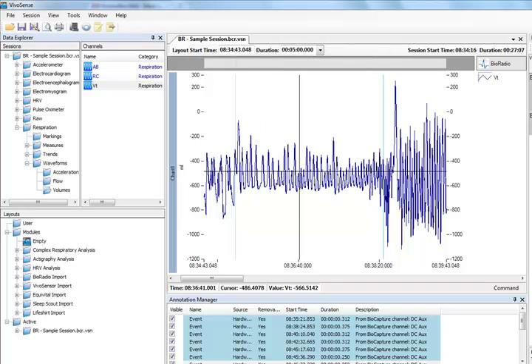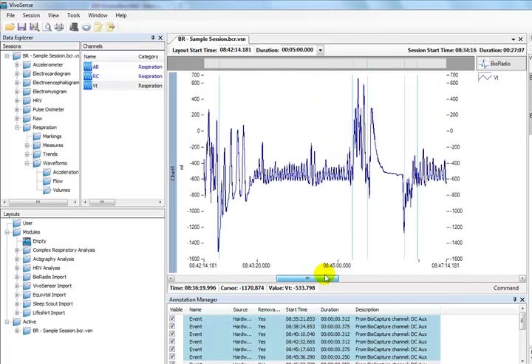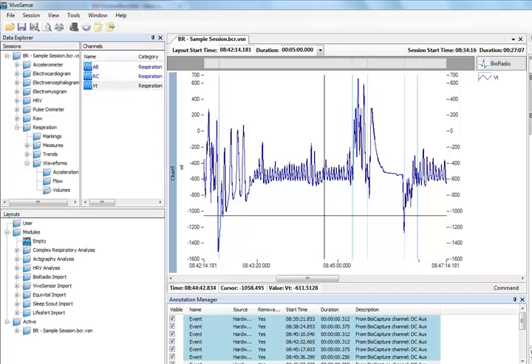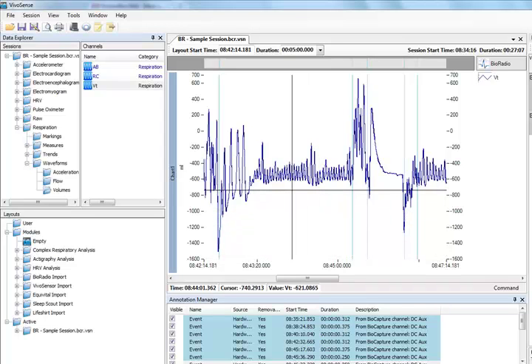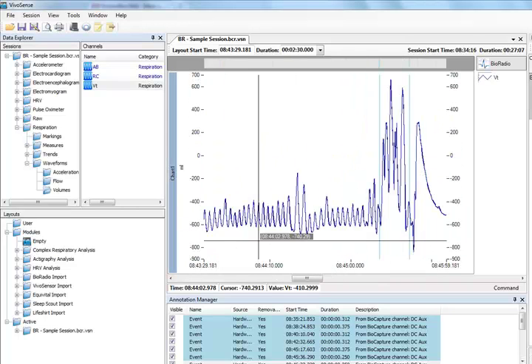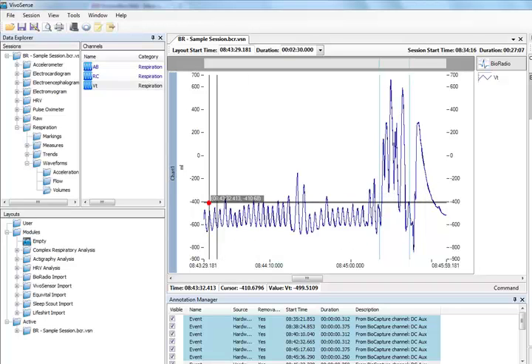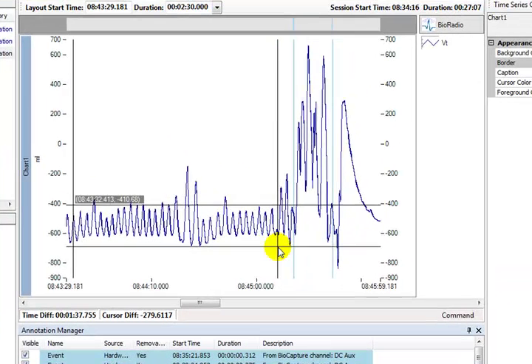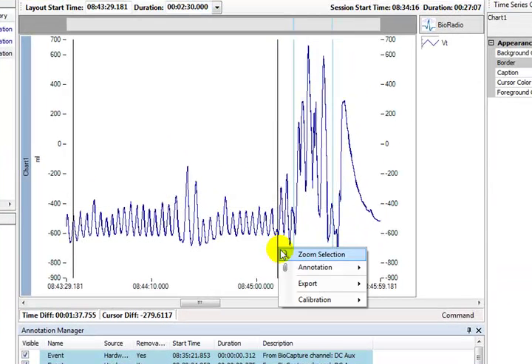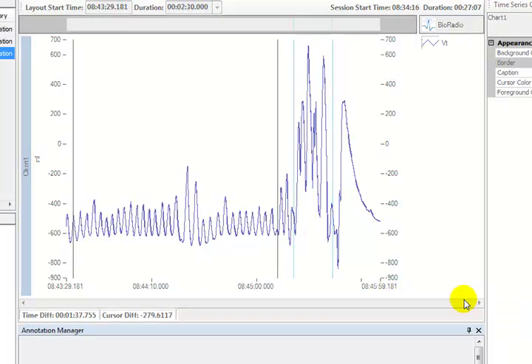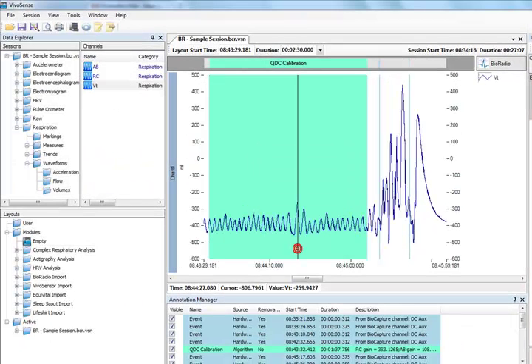We can now manually perform QDC calibration. This means that the user selects the region to apply the calibration versus this region being automatically chosen. On the VT channel, we use the left mouse click and drag across the range over which we want to do the calibration. We must select a range that includes a minimum of 16 breaths, otherwise VivoSense will warn us that calibration was not possible. From the resulting dialogue menu, we choose Calibration, Respiration, QDC calibration. VivoSense will calibrate over the range and show a dialogue with the results of the calibration. Press Yes to accept. Note that we recommend a 5 minute period of stable respiration for application of QDC.